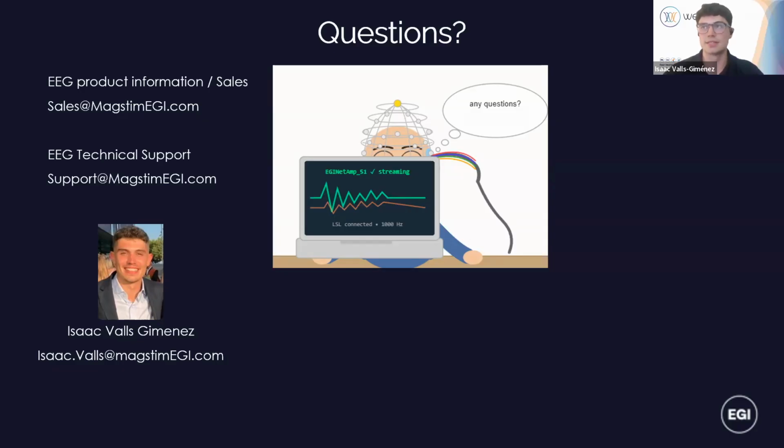As soon as these wireless or any connected devices are recognized, it uses peer-to-peer time synchronization, working with clock offsets that are updated frequently, and then it aligns all of these streams together. It handles this quite well. That's maybe one of the strongest points of LSL for sure.